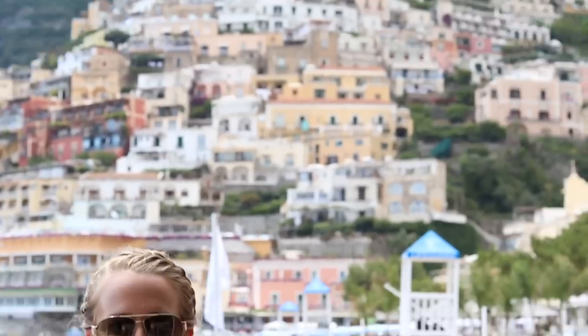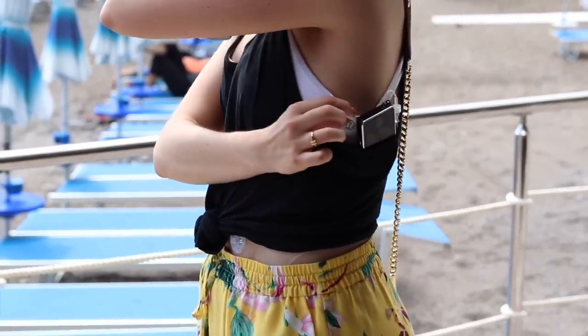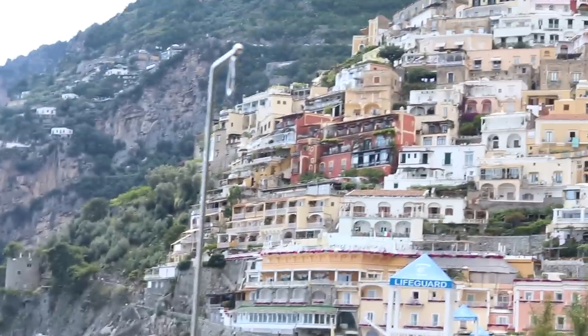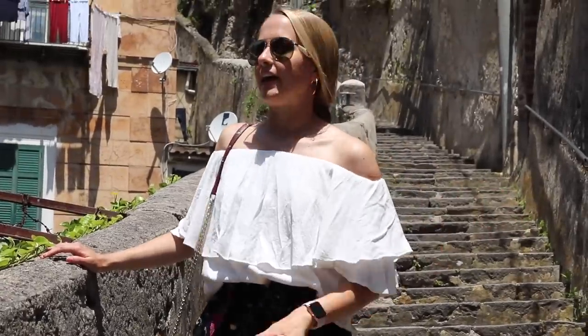Today I'm in beautiful Positano and we just went hiking, so I'm wearing my insulin pump clipped to the back of my sports bra.